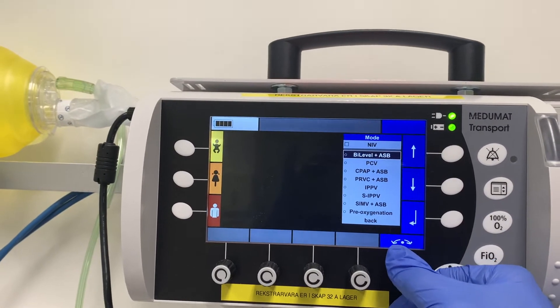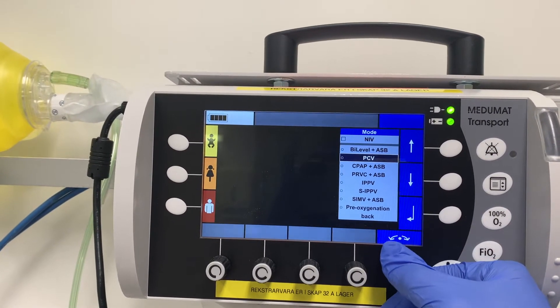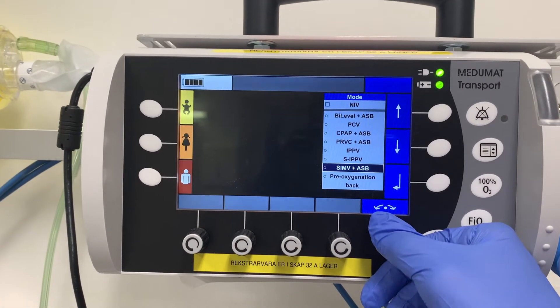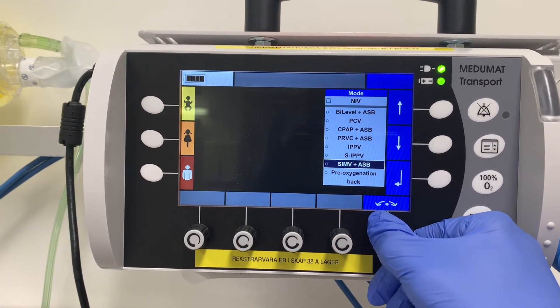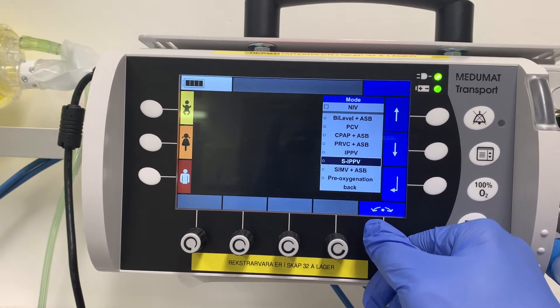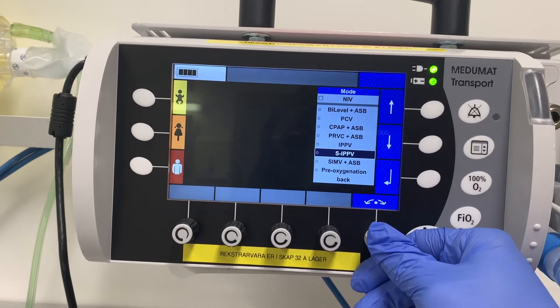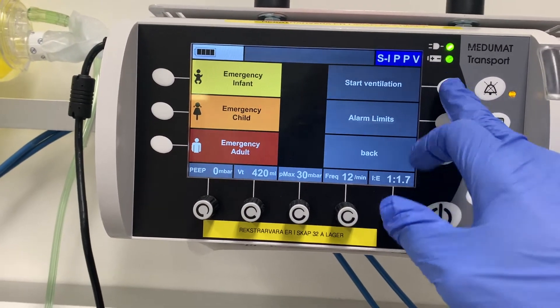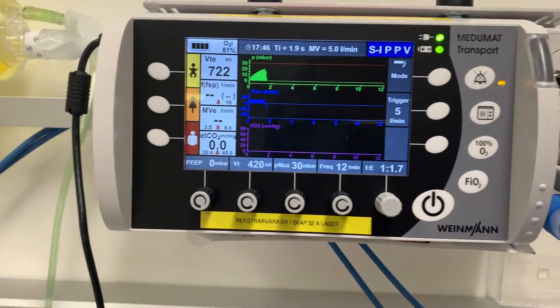Now we choose the mode. We have bi-level, ASB, PCV, CPAP, PRVC, IPPV, SIPPV, and SIMV. The three modes of interest for us are IPPV, SIPPV, and SIMV. I'm going to choose SIPPV and then press 'start ventilation.'